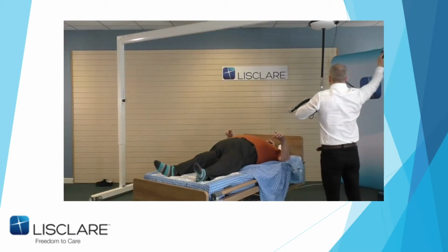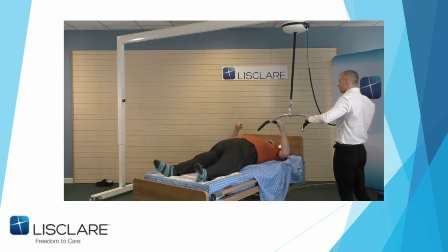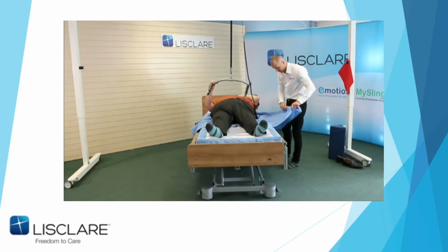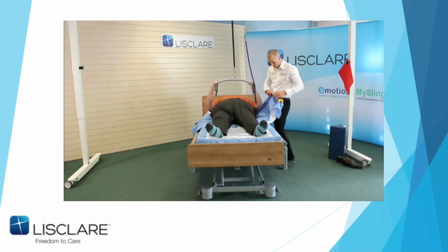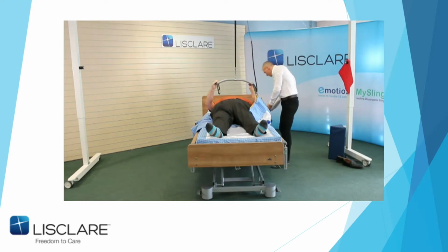So what we're going to do in this case is John's just going to lower. This is the plus size bar. You can see it's a big H system to give me a bit more room for my torso. And John's just going to connect the lifting loops onto the sheet. But he's doing it slightly different. You might have seen this in the acute setting, where this would be even like a repositioning sheet, okay?